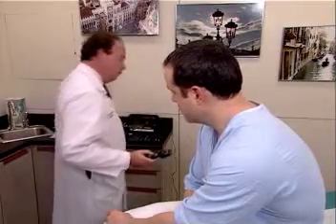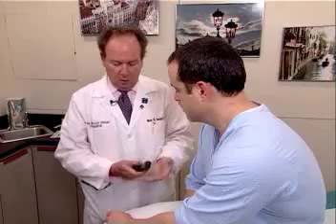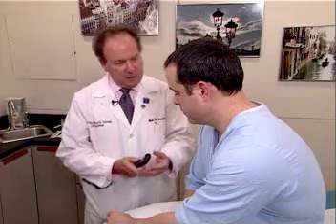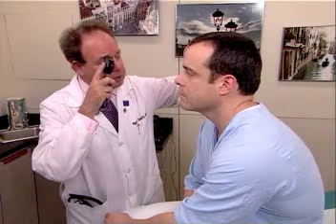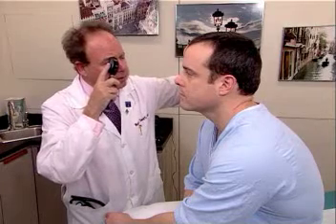In order to do this, you should remove your glasses and have the patient remove his or her glasses as well. If the person is wearing contact lenses, or if you're wearing contact lenses, they may certainly be left on. The light should be placed on, as I'm demonstrating here, and the patient is asked to look in the distance. You should stand approximately 15 to 20 degrees off midline and elevate the patient's upper lid as the ophthalmoscope is placed against your right eye to examine the patient's right eye.